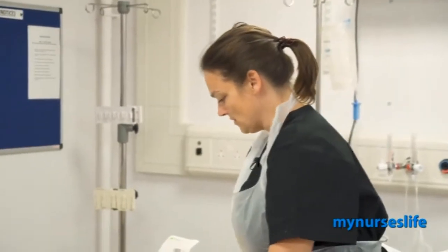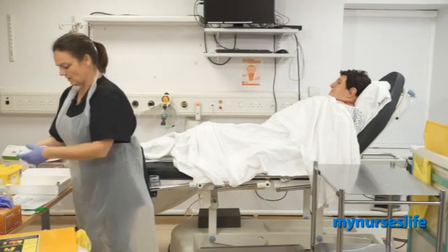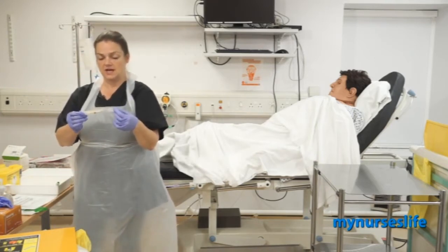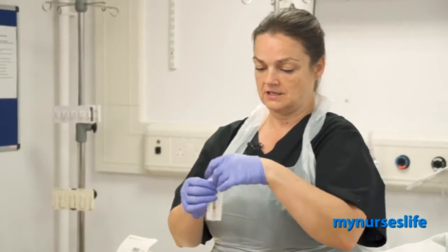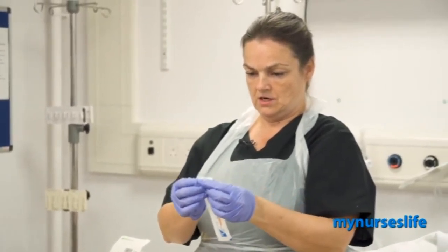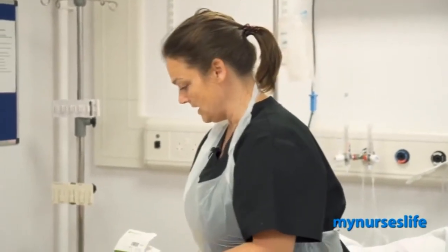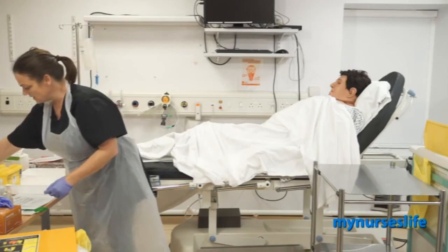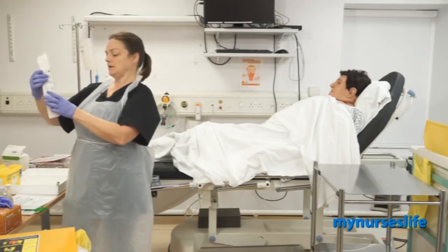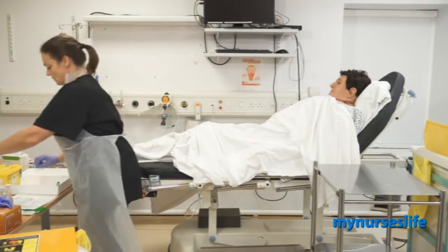So I'm just going to put that in my tray ready and just get the equipment I need. So I would take an insulin syringe. This one's intact, and the date is here. It says the 2nd, 2024. So I'm going to put that in there, and I'll take a swab for post-injection. And that is 2023, 12/2023. So I just need one of those.